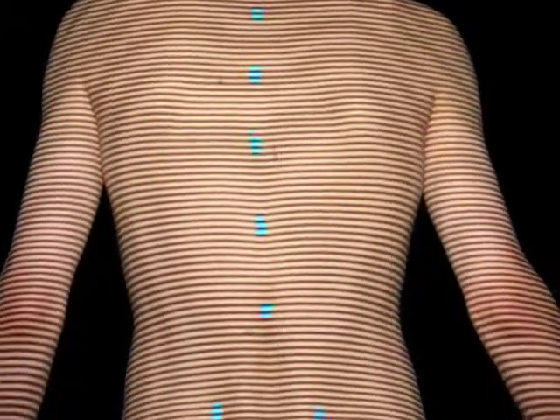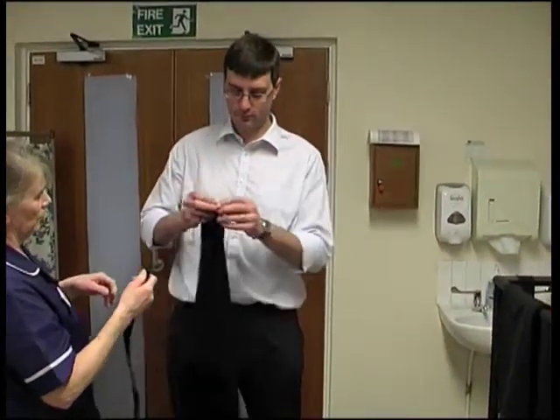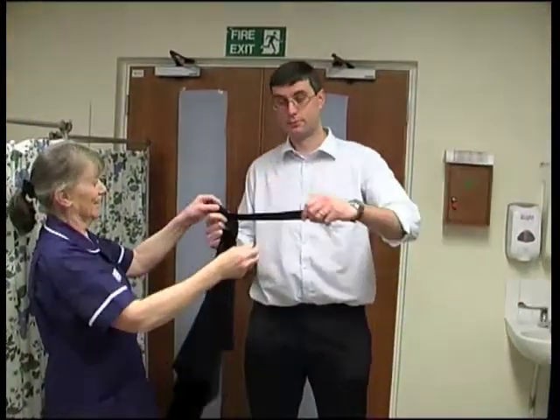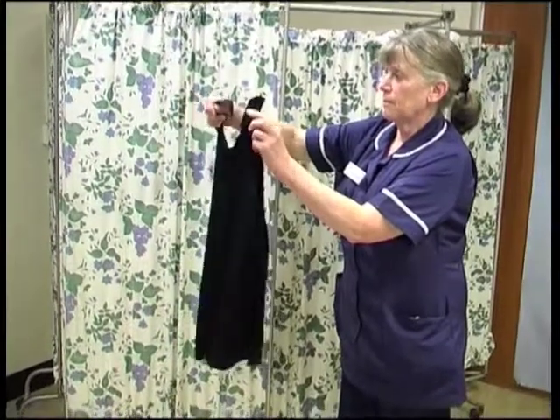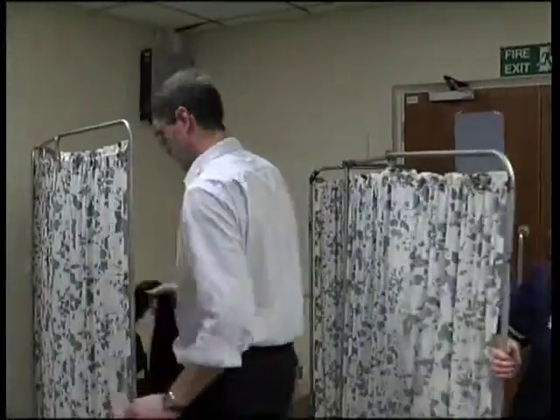Here is Mr Gardner, one of our spinal surgeons. We'll show you his back being measured. You will need to take off all your upper body clothes, loosen your trousers or skirt, and possibly tie up your hair. We will give you a black apron and a black neckband to wear. For girls, we have a halter neck top so that their fronts are covered. The black neckband and apron help to speed up the computer analysis. There will be a screened area where you can get changed in private.